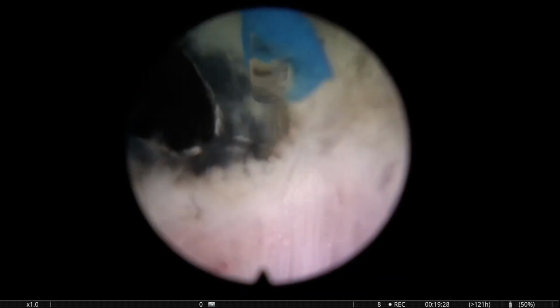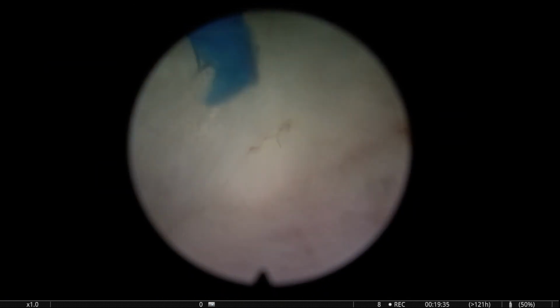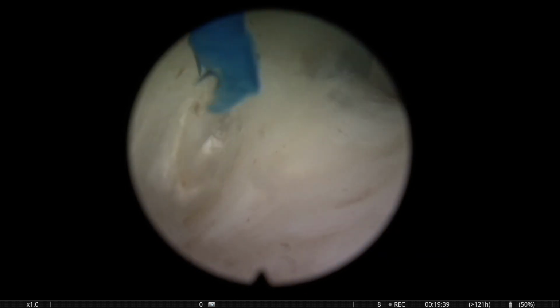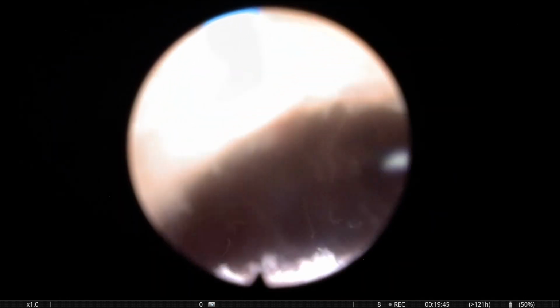But yeah, I think if you look for a beautiful plane, you will be frustrated many times because you cannot find it. You cannot find it all the way around the prostate. Maybe you see a good plane posteriorly but not anteriorly, or vice versa. You know, there's a lot of variability.